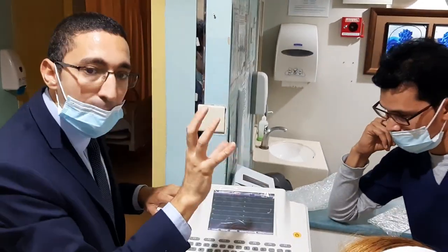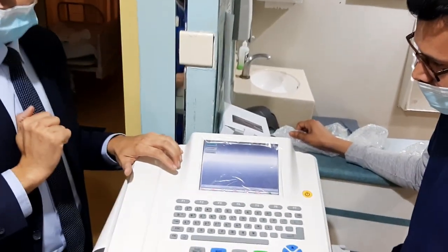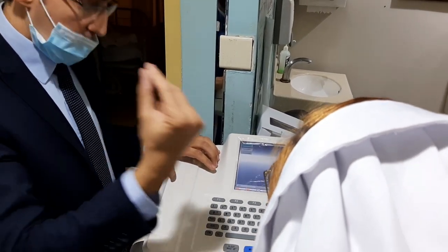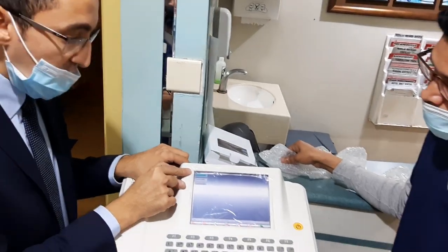About the history of the patient, about the cases, from the file menu you can retrieve the file, the data. Retrieve. For file, all the patients will appear here. See, it's by date, by ID.